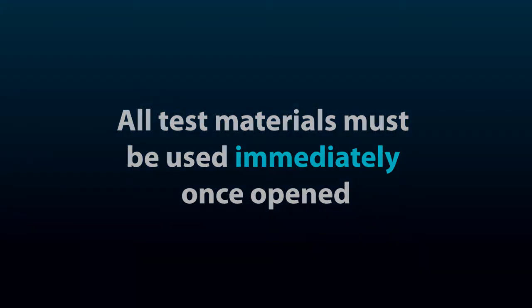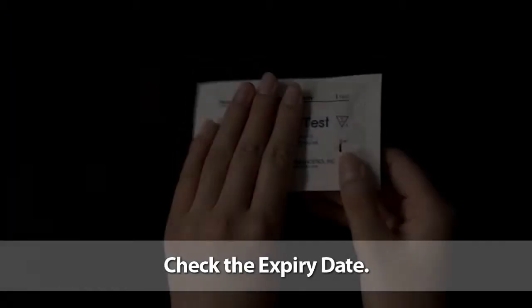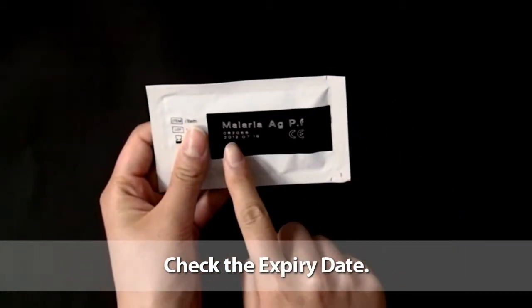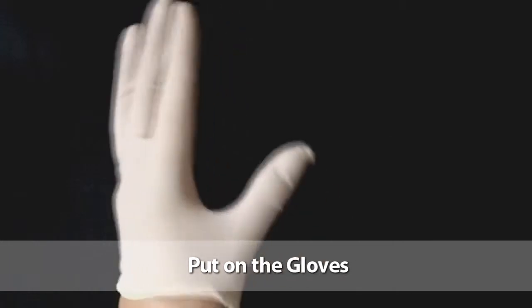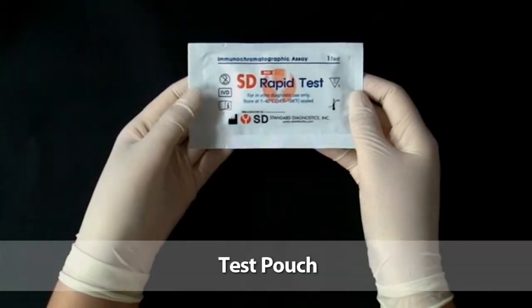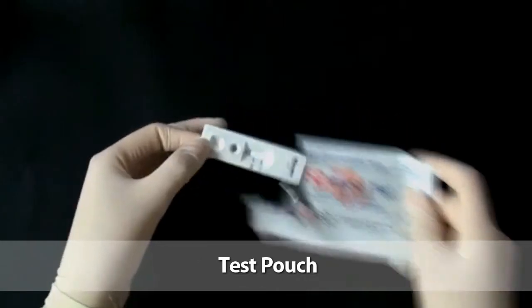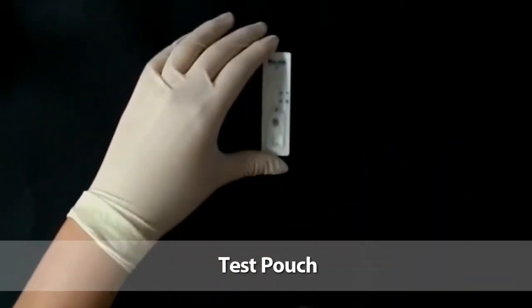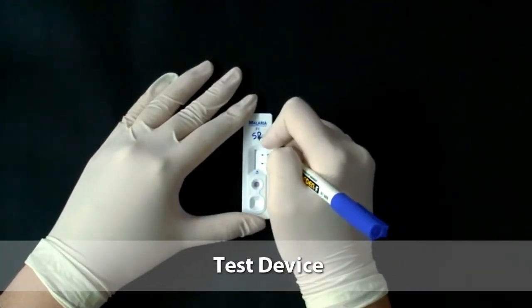Let's begin the test. Check the expiry date on the back side of the test pouch. If expiry date has passed, use another kit. Put on the gloves. Remember, use new gloves for each patient. Open the test pouch and set the test device. Write the patient's name on the device.